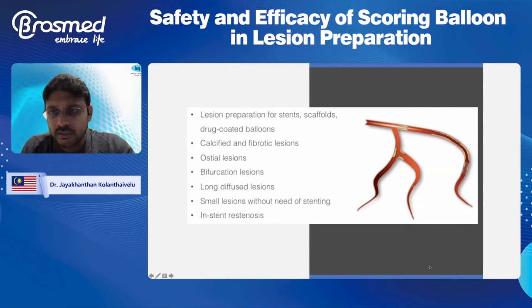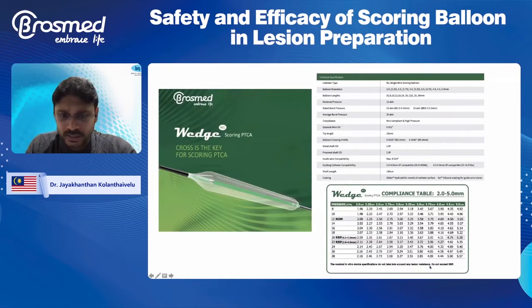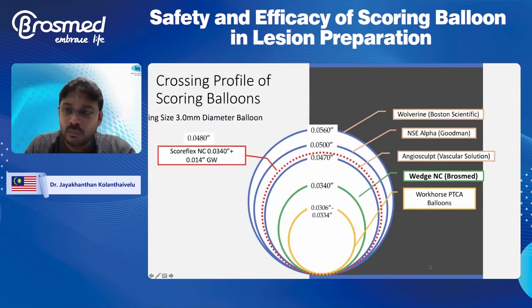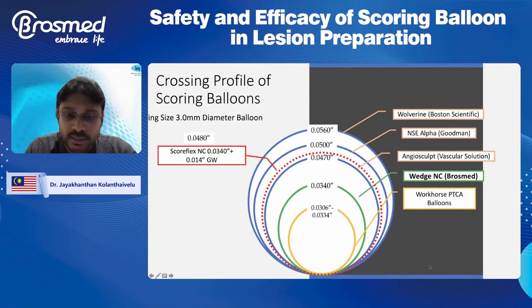Then again, on the indications for usage of scoring balloons, as we go along we will see a sample of a few cases, and we will discuss the pros and cons. Like I said, the RBP is about 22, and you can go up to 28 atmospheres, and they've got a range of balloons in all sorts of sizes, which is really interesting. One important thing about the Wedge NC that I really like a lot is the crossing profile, which is second only to semi-compliant balloons, and that's amazing.